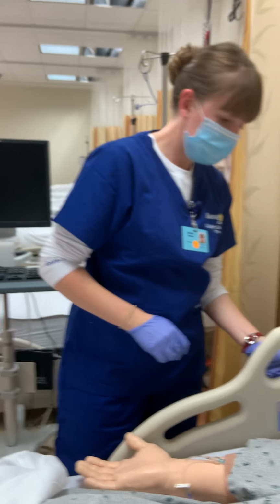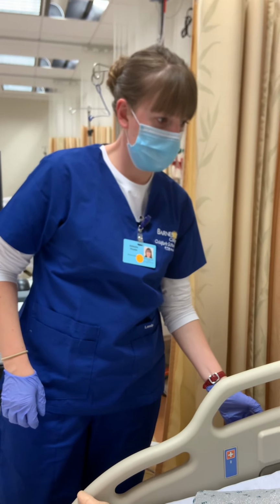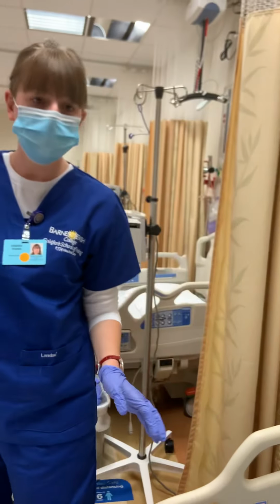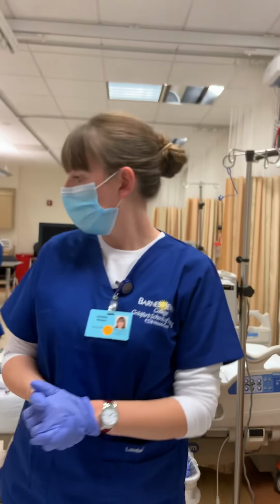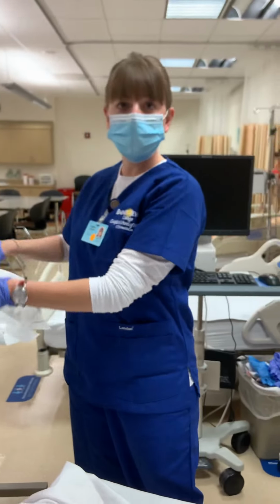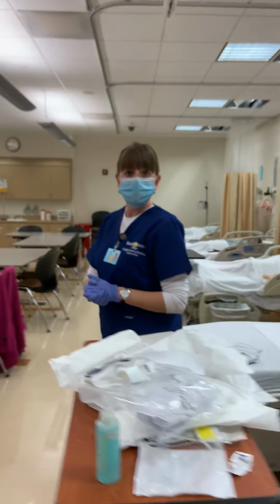You lower your head here. I'm going to make sure it's locked. It is. If you need anything, just call me. I'm going to clean off my table here, both wipe it down and get rid of all of my supplies. And I'm going to leave the room and document everything that I've done.